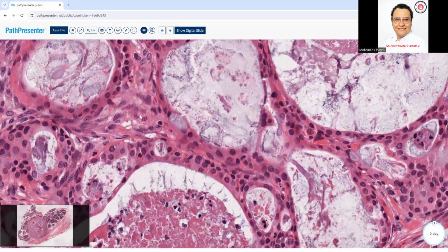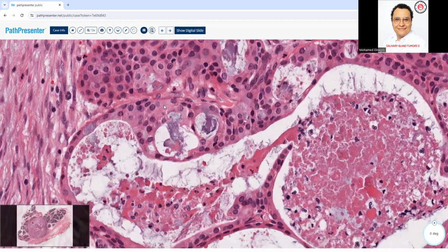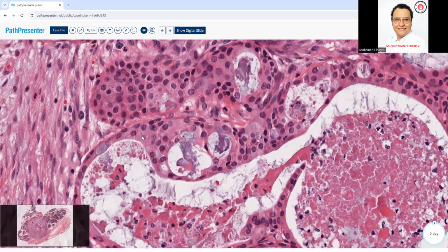So here's the thing. This looks like what Abdurrahman was talking about, the secretory type, the one with the small pink secretion. I always say, I know virtual slides are very, very tough. That's why it is a different skill than looking at pictures, because in pictures they give you the spot diagnosis where you need to look. So based on my narrow experience in dealing with virtual slides, I would say don't jump to a diagnosis very fast.